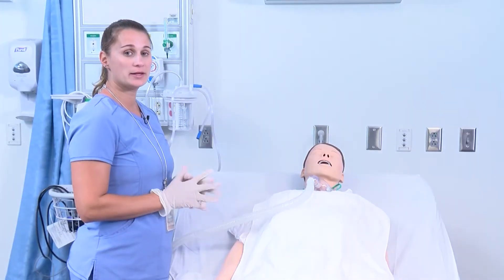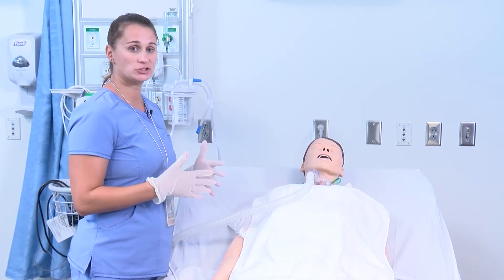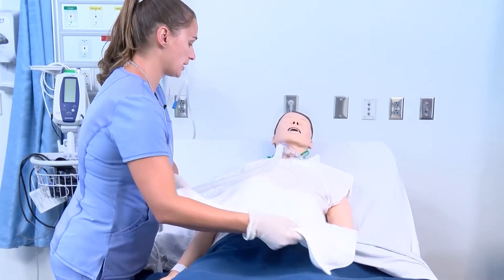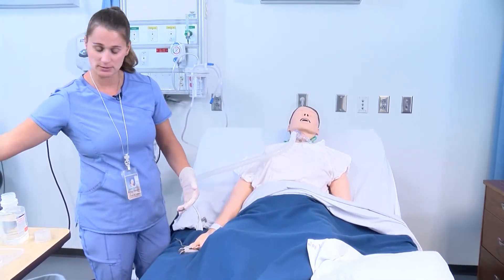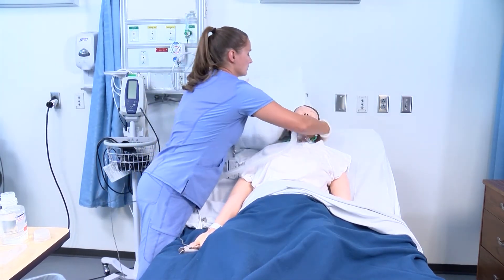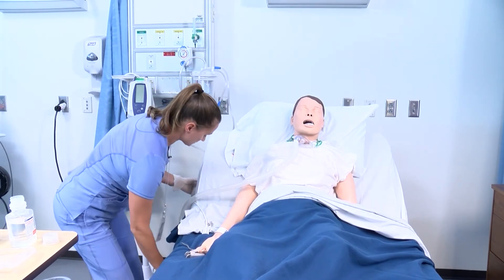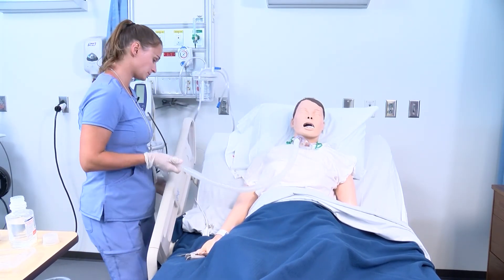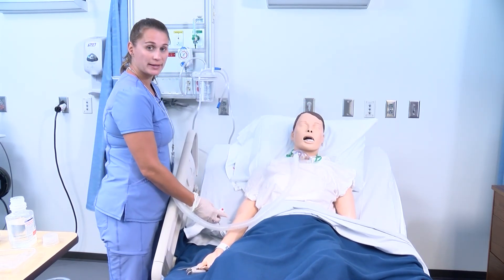Now that I've reassessed my patient, we're all done. I'm going to leave the patient in a comfortable position — take out the towel and discard it in the linens, put the pillow back, put the side rails up, lower the bed, and make sure the patient has their call light.